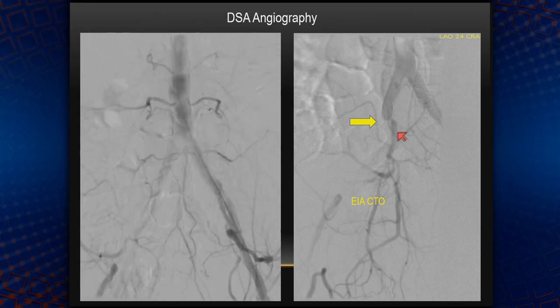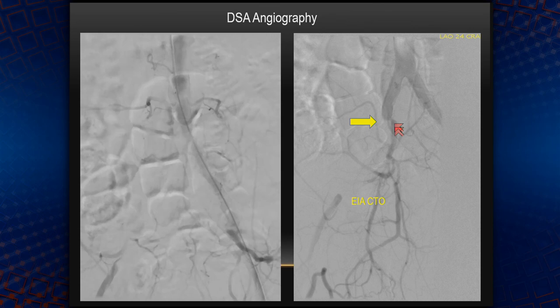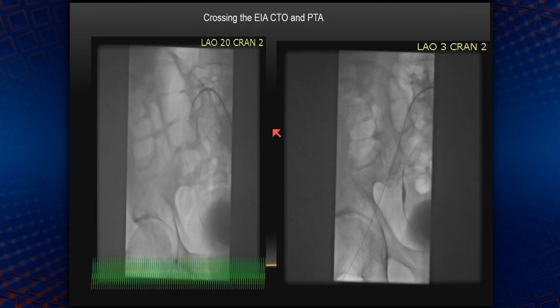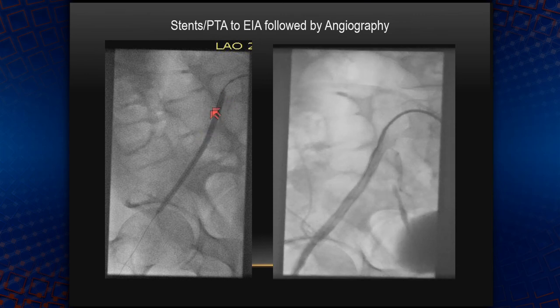You can see the occlusion here. The internal iliac is patent. Then you see reconstitution, then a gap, and then the profunda. The way I approached it: I wired the internal iliac, then advanced the sheath up and around, used a vertebral catheter to get to the ostium of the internal iliac, redirected the tip, then crossed it with a CTO wire — it was an Astato 30-gram tip. From there it became relatively easy: balloon it, stent it, good result.